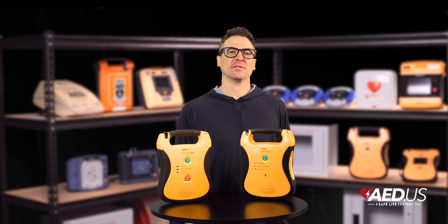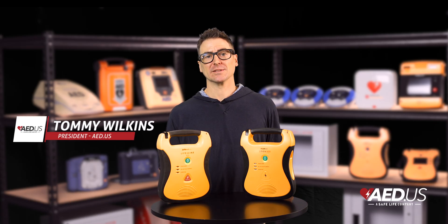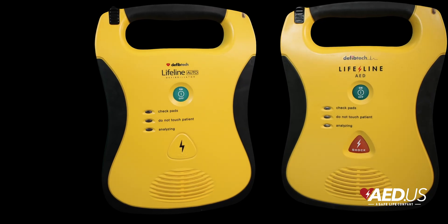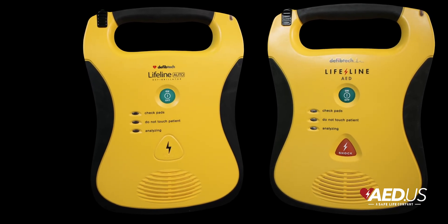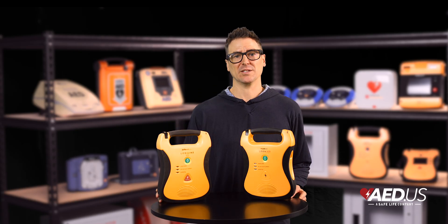Hi everybody, Tommy here with SafeLife. Today we're spotlighting the DefibTech Lifeline AED, a device designed for simplicity, durability, and reliability. Whether you're a first-time responder or an experienced professional, the Lifeline AED is built to guide you through emergencies with clear instructions and perform seamlessly in the toughest environments. Let's dive into what makes the DefibTech Lifeline AED stand out.